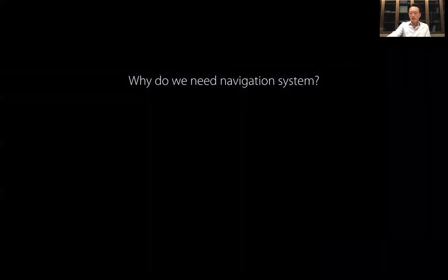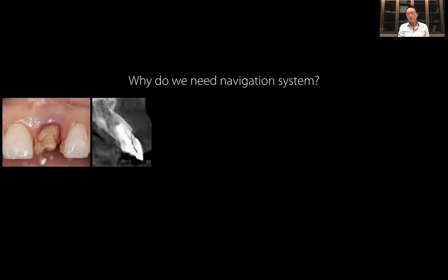Okay, so let's get started. First, many people will ask the question, why do we need to use a navigation system? Let me share with you a case I treated a number of years ago. This patient came in with a fractured maxillary left central incisor, and on the CBCT scan image here, we can clearly see a fracture line.